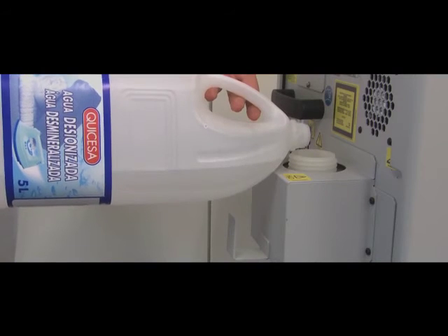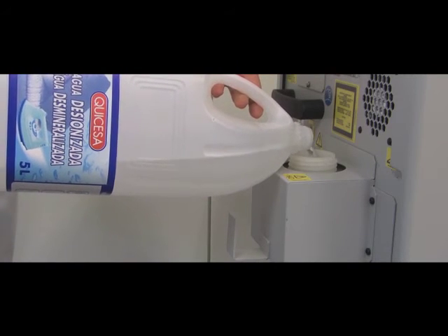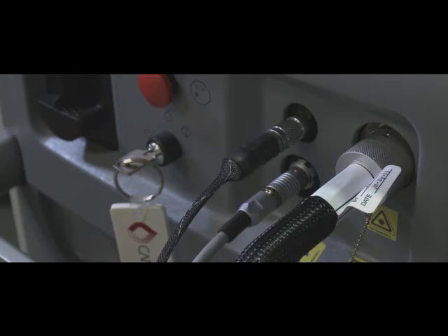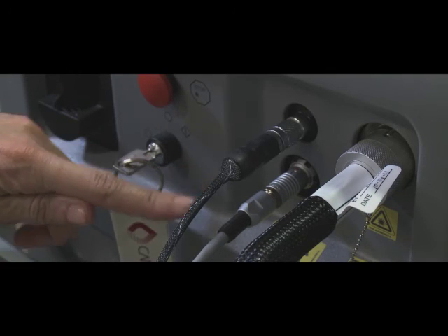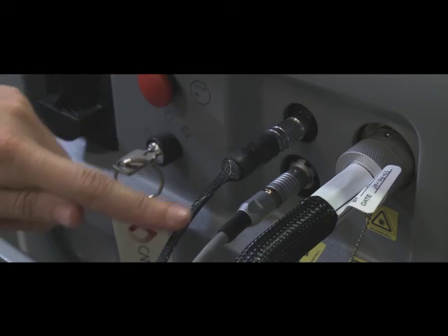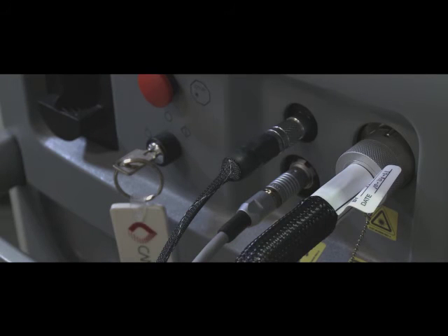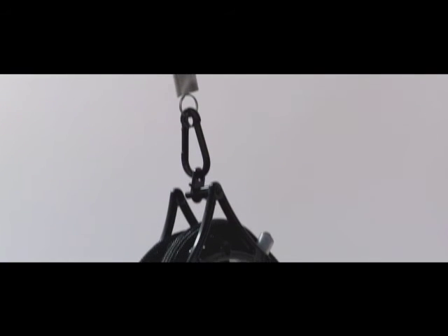The water canister should only be filled with distilled or deionized water and should be checked weekly. The back filter is easily removed and cleaned with a vacuum or canned air once per week. The delivery system consists of the electrical cord, the cryogen line, and the optical fiber. It must be handled at all times with extreme care. Make sure the cables are hung and not on the floor.